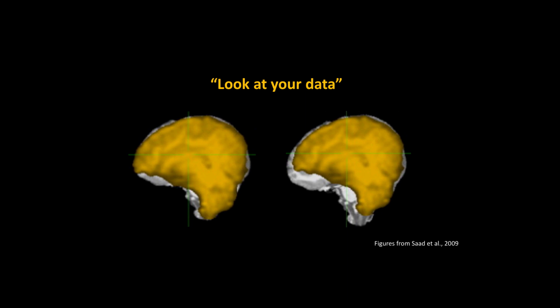Now, if I were to take a poll, which of these two methods seems like it did the better job if you were to look at those overlays? Who says the one on the left did a better job? Okay. Who says the one on the right? That's totally reasonable. The one on the right seems to have missed a lot of the brain for whatever reason. A lot of signal got cut out, and most people would go with the one on the left. But again, it really depends on what your thresholds are for what you want to include.